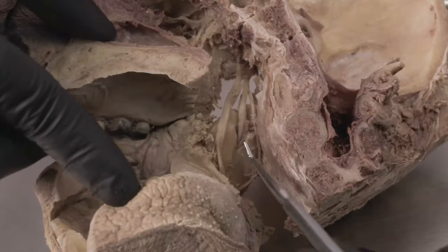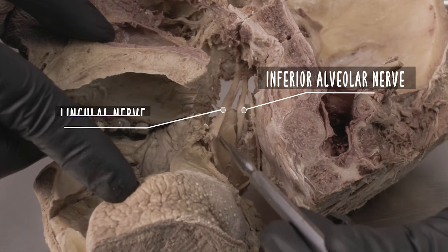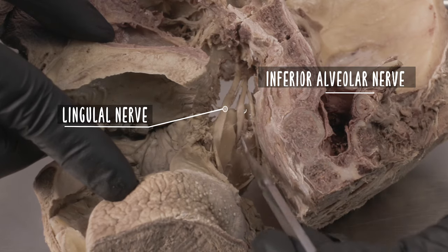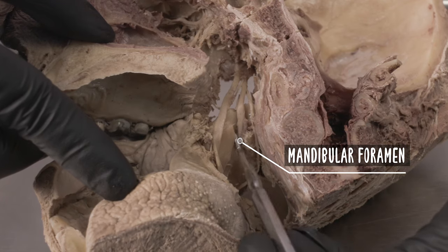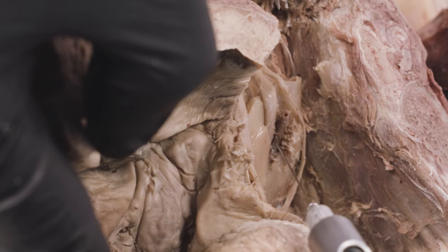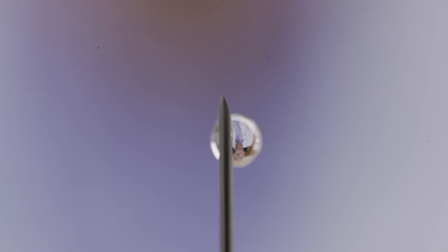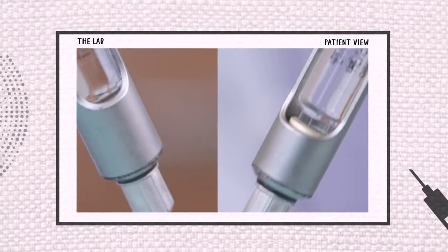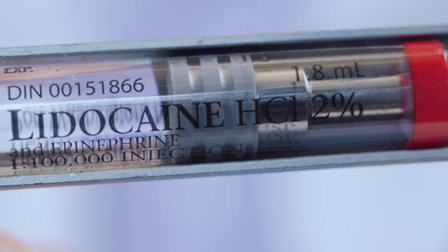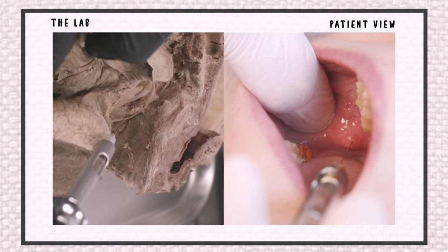On this prosection, you can see the inferior alveolar nerve, the lingual nerve, the mandibular foramen, and the lingula. With the layers peeled back, you can aim right for the lingula. Now, let's take a look at the actual patient and see how we do the injection. With the tissues back in place, I can use landmarks to overcome my blindness.